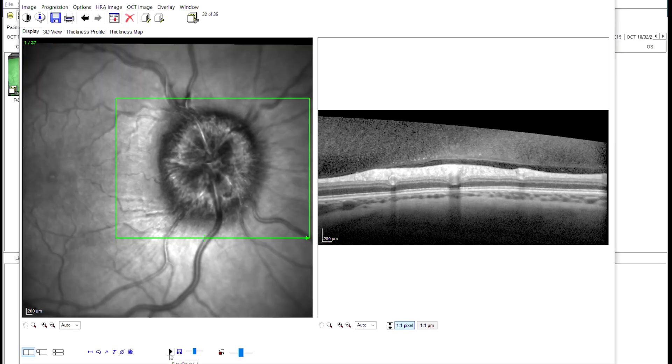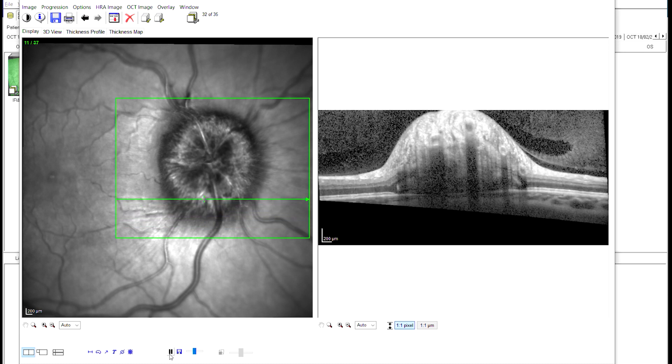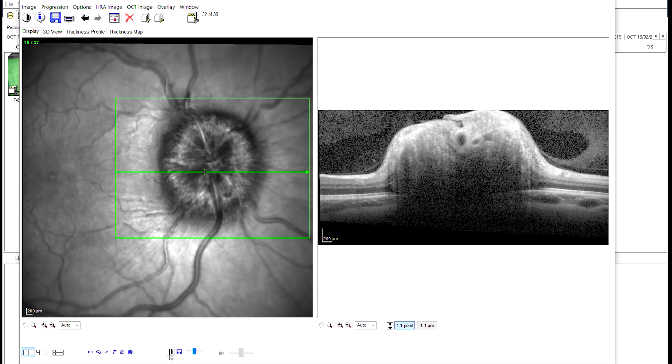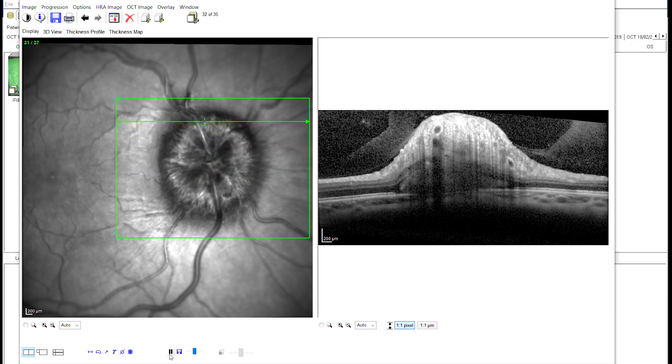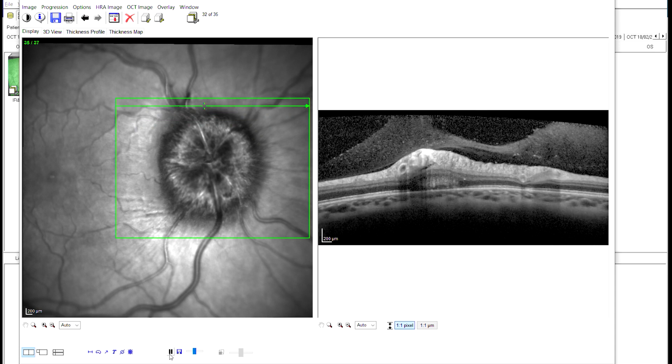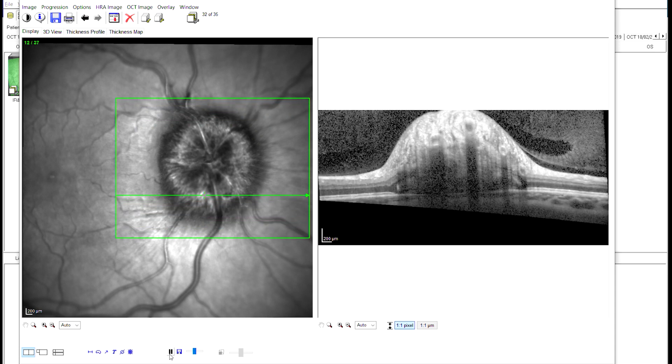Be aware that when scanning a patient with significant papilledema, it is vital to continually adjust the position of the camera to accommodate the increasing size of the OCT image. This is to ensure that the top of the OCT image is not cut off, hence losing the data required to determine peak height of the disc.